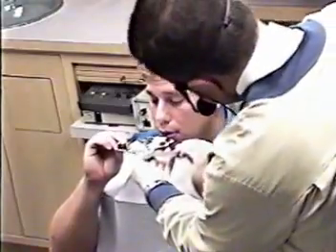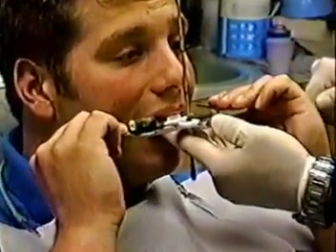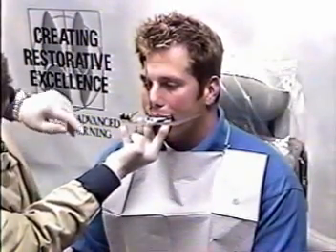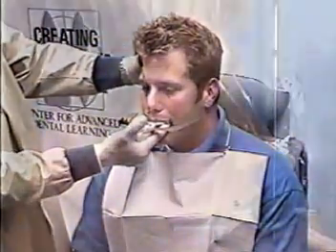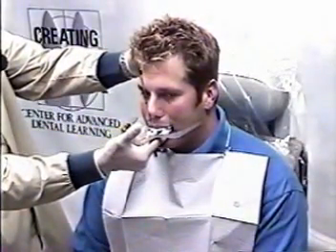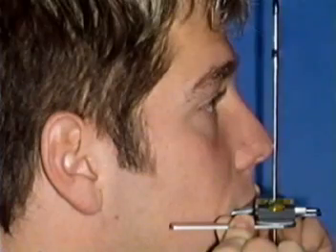The patient then grabs the tray and we guide it into the mouth. The key step here is to let the little vertical component on the tray bump the central incisal edge. The face bow is then positioned on the patient's face and the vertical rod is centered right over the glabella. Notice the rod is positioned perfectly vertical in the patient's face and precisely along the facial midline, not the dental midline.